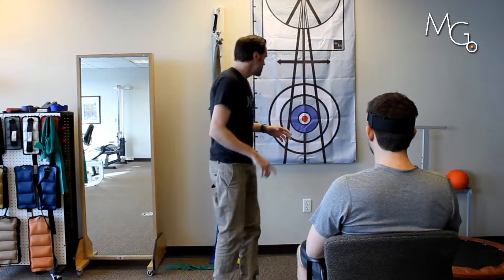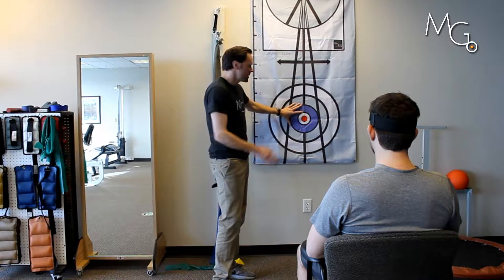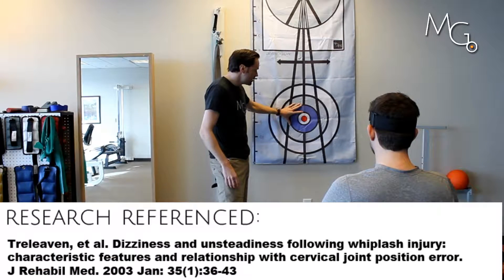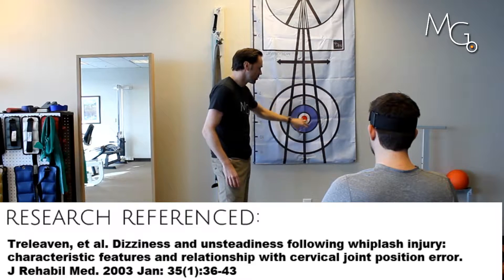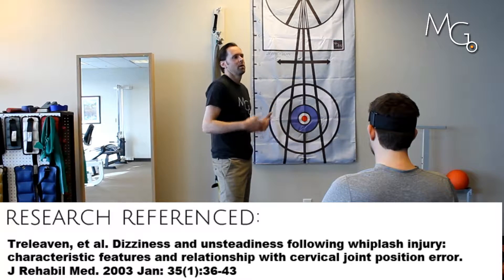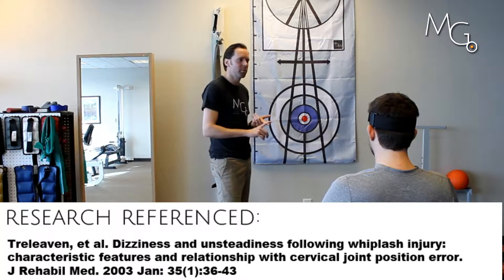This circle here is standardized for a distance of five feet away if the patient's sitting. If they're able to come back to this target, anywhere in this blue circle from five feet, that's showing somewhat within what a normal population can do or perform — a population without pain, without injury.